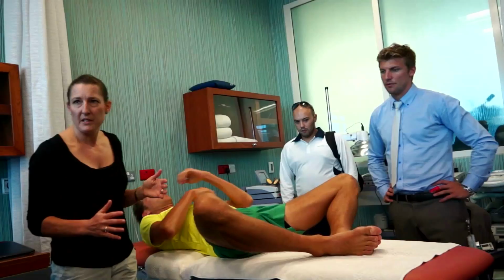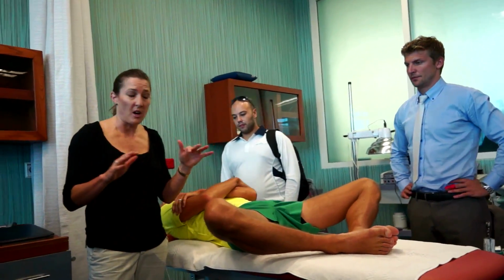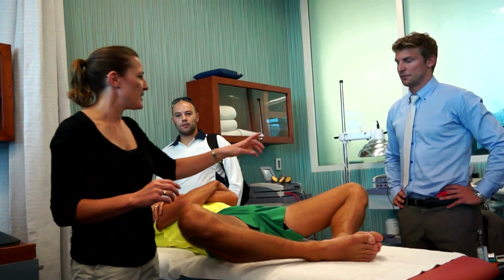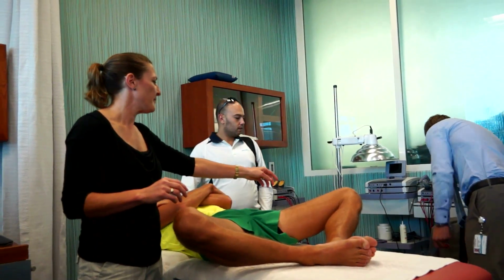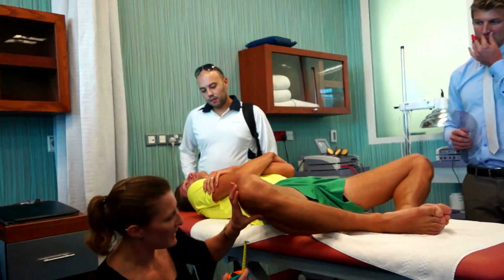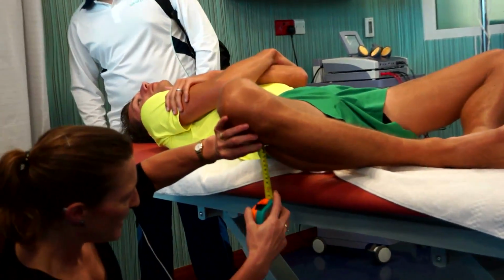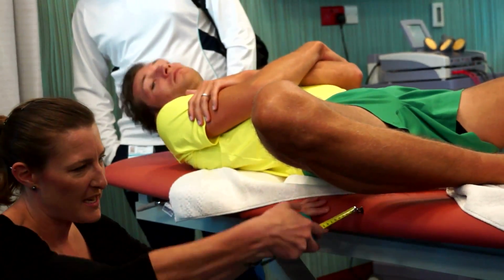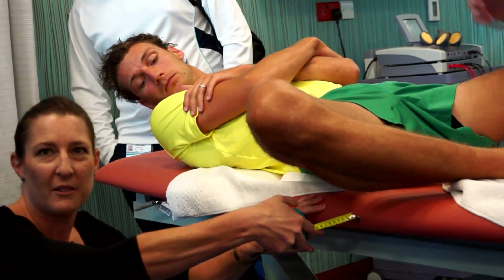When the test is described in the literature and the reliability, which was very high, was published, it was described as bringing the rigid tape measure to the line of the bed. So obviously we need to be in the line of the bed, but as you can see quite clearly on these beds, it's curved. So do we take it from here? Do we take it from here?